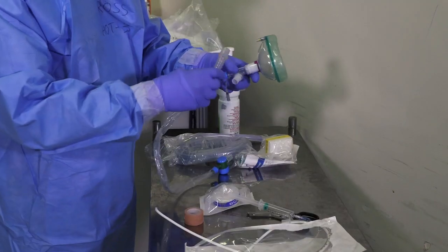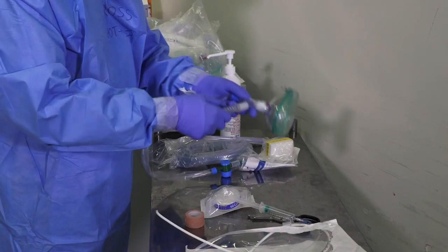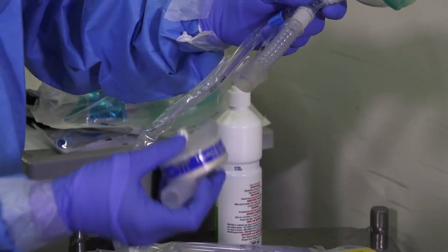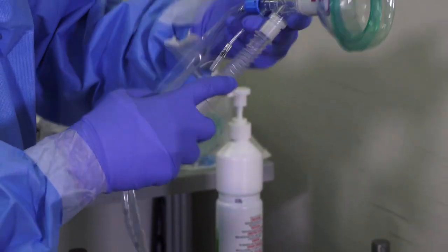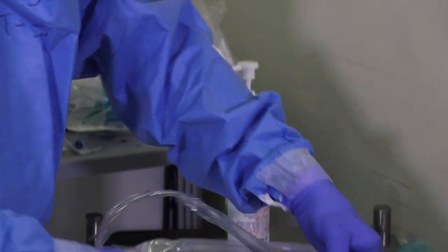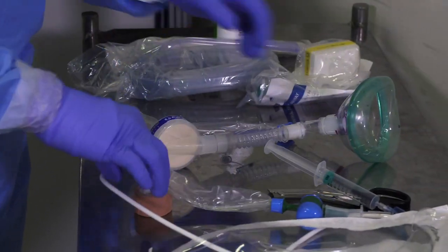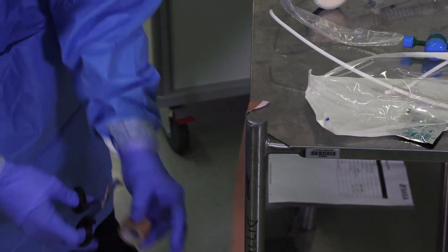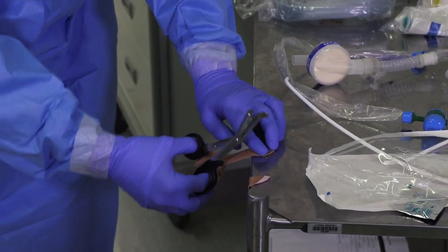We can construct the circuit in the order suggested in the checklist: mask to closed suction unit, to corrugated tubing, to viral filter. Have your tape pre-cut — you don't want to be doing fiddly tasks in the heat of the moment.